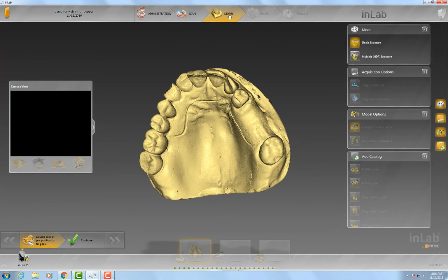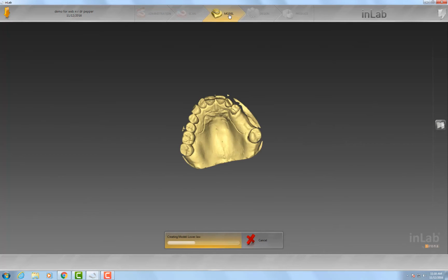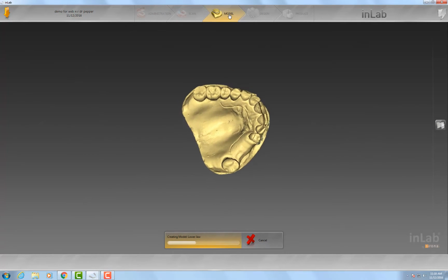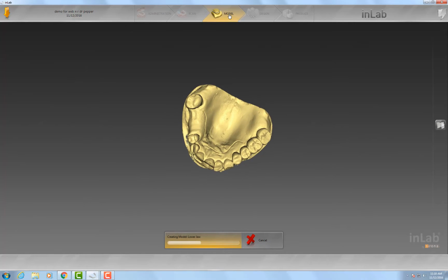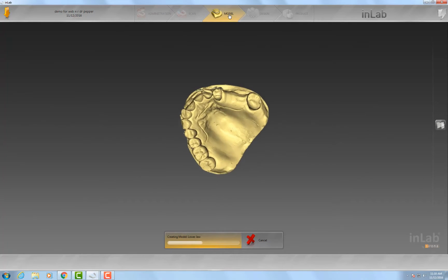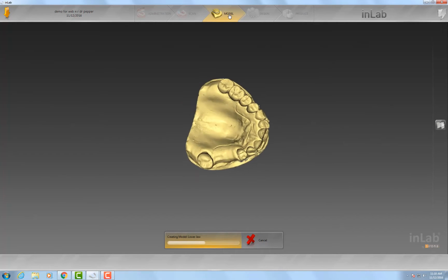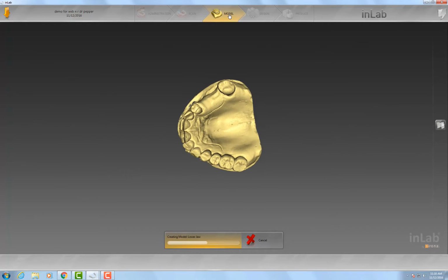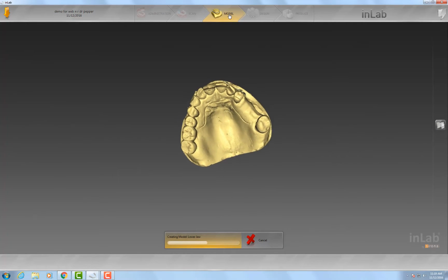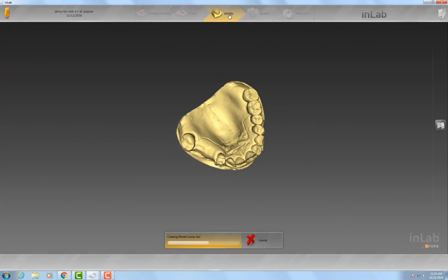Going back to the thinking process, how we have grown from it is we were able to put physical numbers to paper. Doing the traditional method, we found it took an average of 30 to about 45 minutes from the model being out of the dupe to finishing the product in investing and casting, for an average to intermediate complex design.